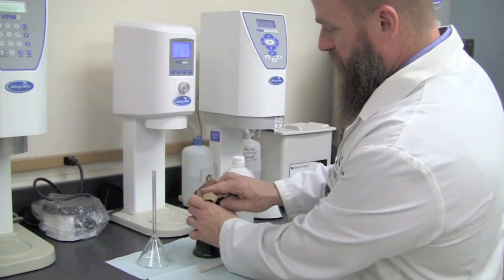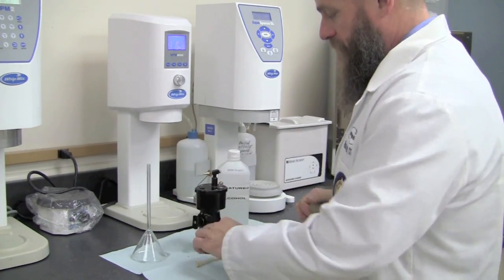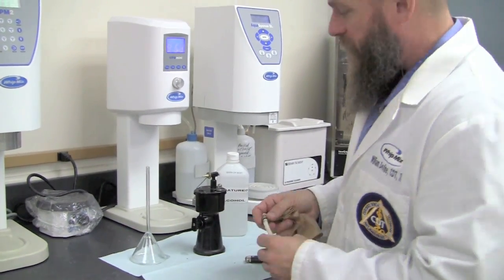In the event we do spill alcohol, it's very important that we wipe off any of this spillage. Now we're ready to insert the wick and wick holder.